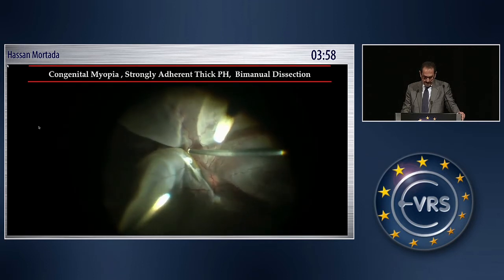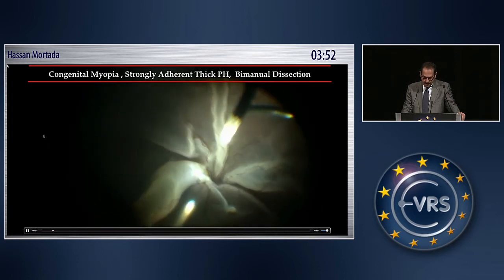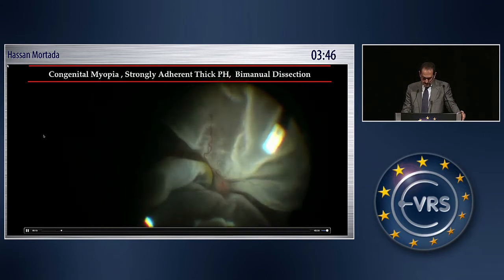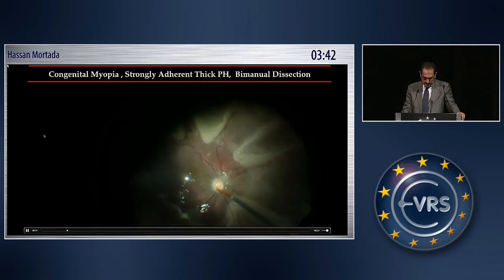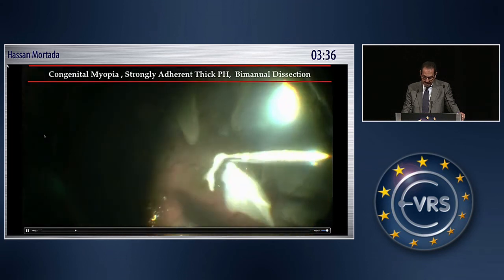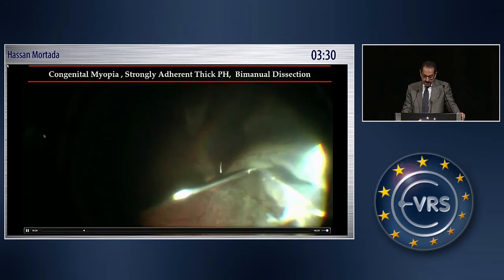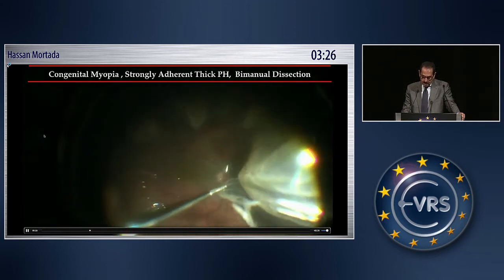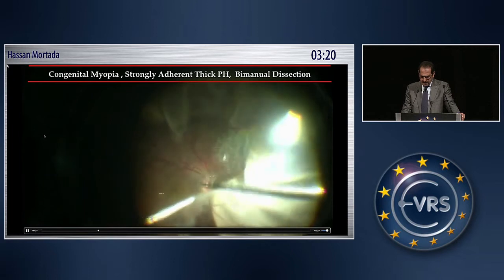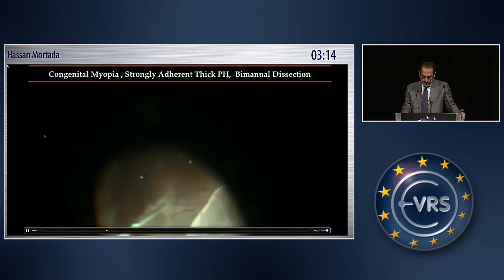This is another case of congenital myopia, and you can see the adherence of the posterior hyaloid with the retina. Several attempts were made with the use of the probe, and this is the Ferenc forceps — it's really very good forceps. Then the posterior retina is stabilized with PFCL.